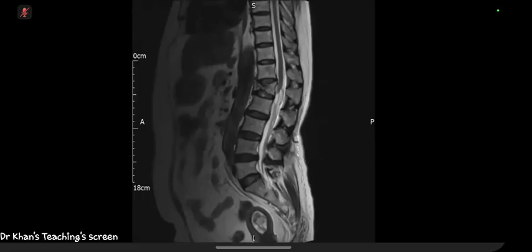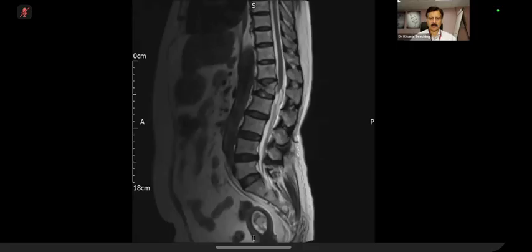So for the endometrial cancer, I'd recommend an MR pelvis gynae protocol to further assess the lesion and a CT thorax. And for other things? CT thorax abdomen pelvis to stage the cancer. No, just give me your diagnosis on the other 2 findings. Oh, the other things. Okay.